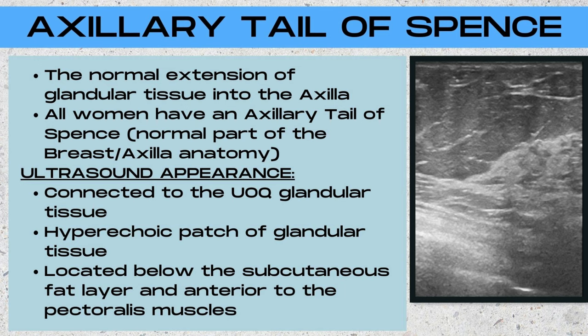The axillary tail of Spence tissue is located below the subcutaneous fat layer and anterior to the pectoralis muscles, just like normal glandular tissue. When you encounter glandular breast tissue in the axilla, ask yourself two questions. First: is it connected to the upper outer quadrant tissue? If it is, it's the axillary tail of Spence. If it's a separate patch of tissue not connected to the upper outer quadrant tissue, then it's accessory tissue. Second: what is its depth on the ultrasound image? The axillary tail of Spence is located below the subcutaneous fat layer and anterior to the pectoralis muscles, while accessory breast tissue is very superficially located — directly below the skin line and above the subcutaneous fat layer.